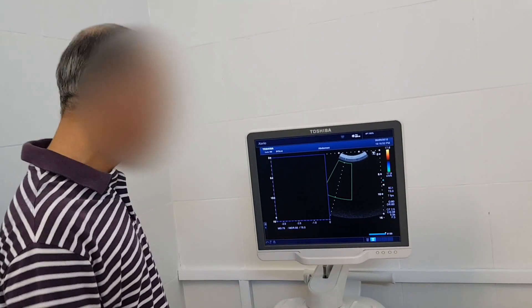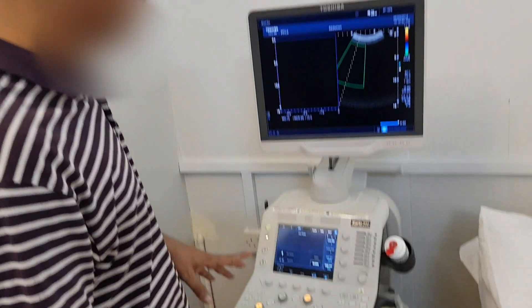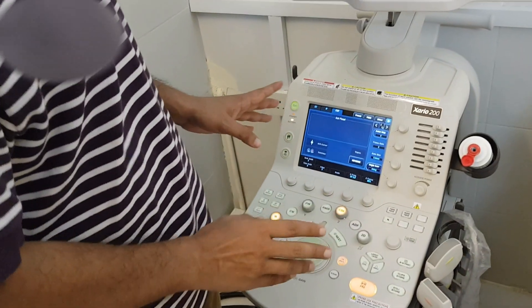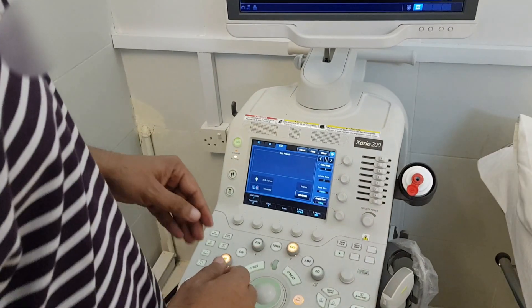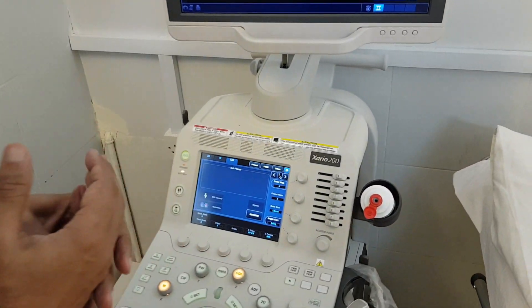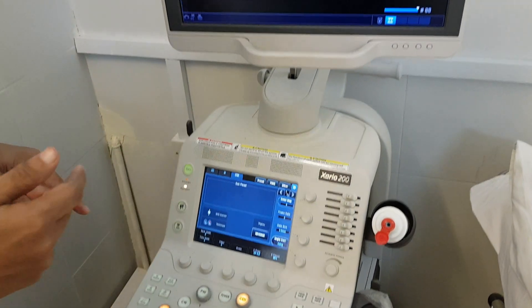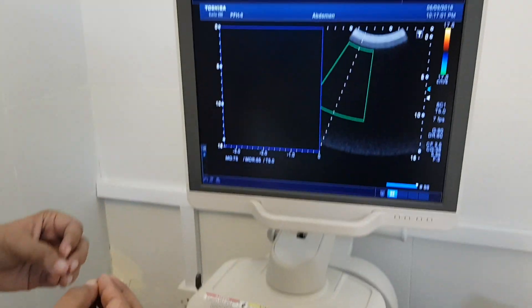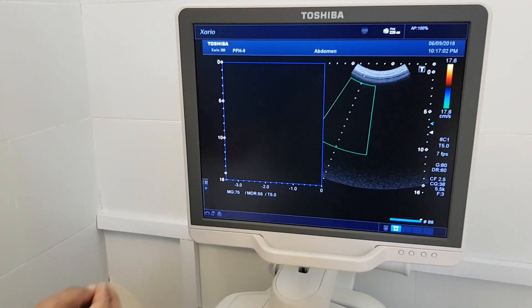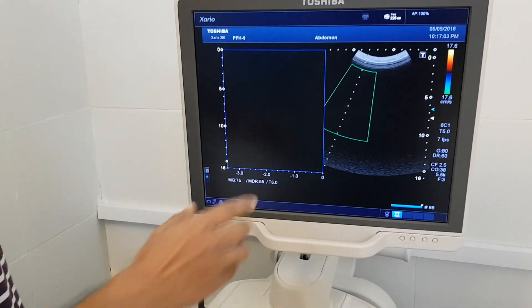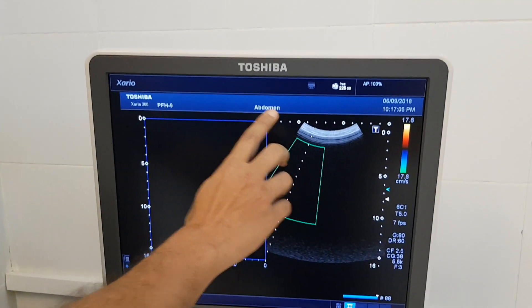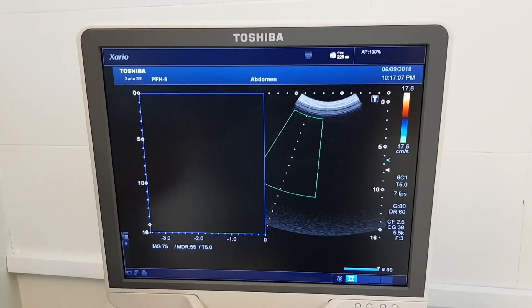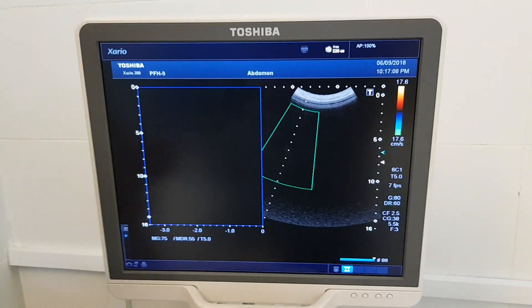Now we need advanced functions of this machine — we have done the basic functions. Now we use special ultrasounds. Generally, every machine has a setting by default to the abdomen. You can see here 'abdomen' is written, which means that in this mode you can scan the abdomen.